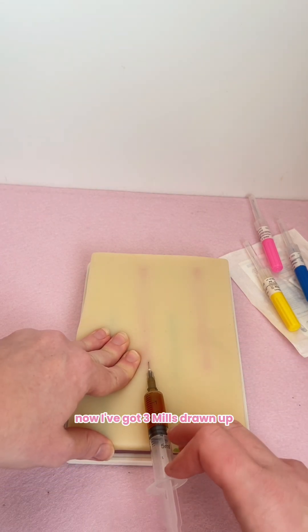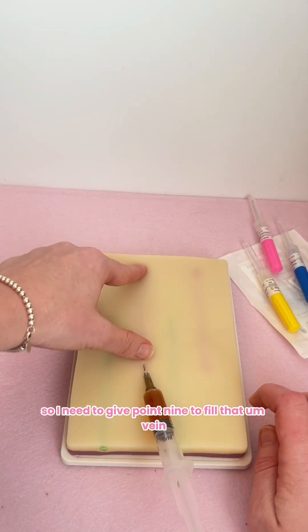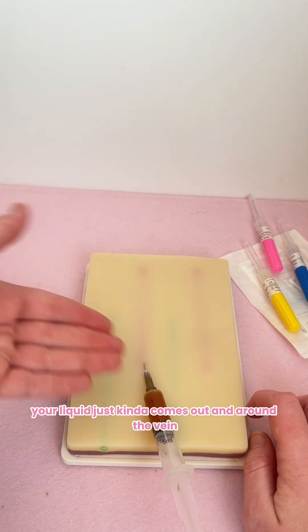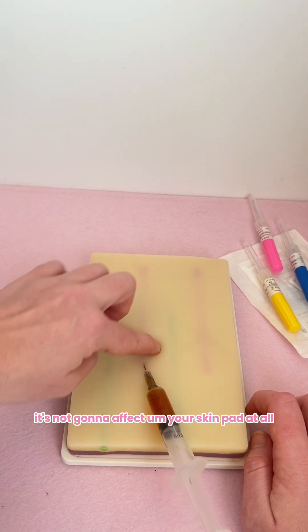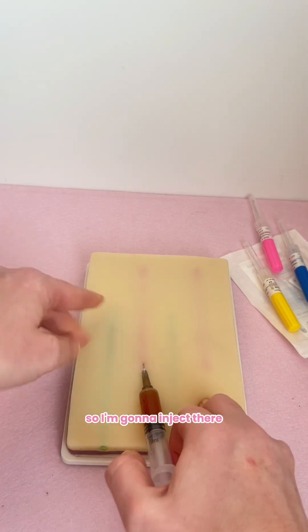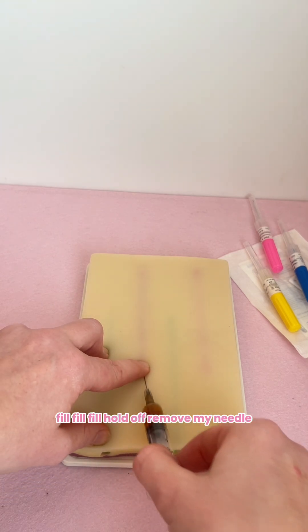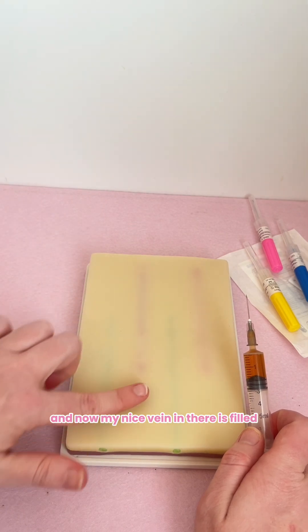I've got three mils drawn up so I need to give 0.9 to fill that vein. If we do overfill these, the liquid just kind of comes out and around the vein, which is fine — it's not going to affect your skin pad at all. So I'm going to inject there — fill, fill, fill, hold off, remove my needle, and now my vein in there is nicely filled.